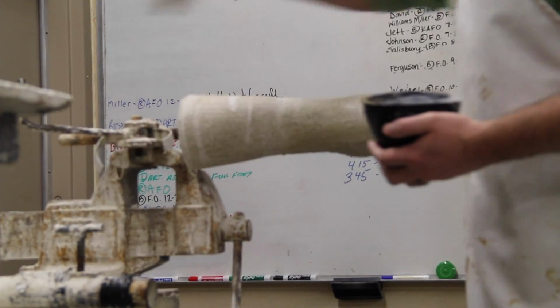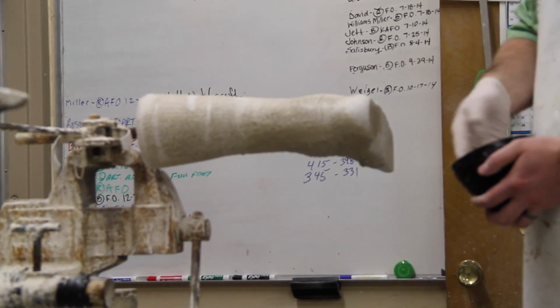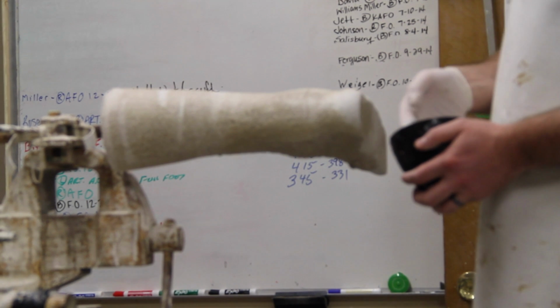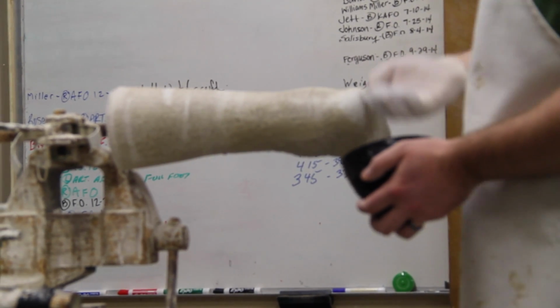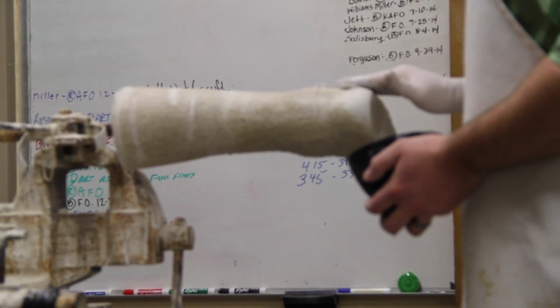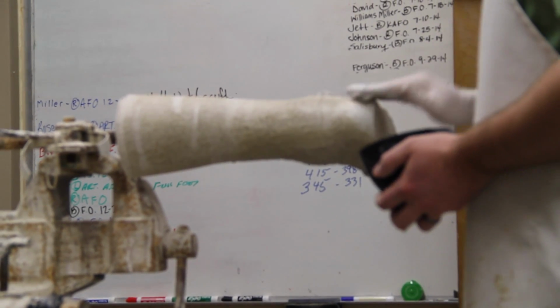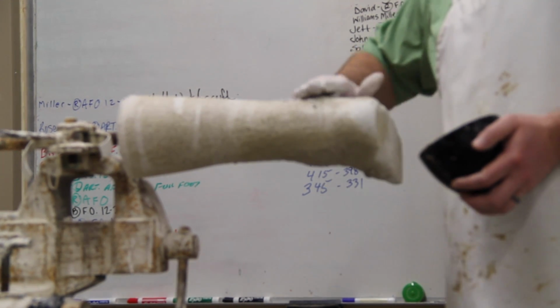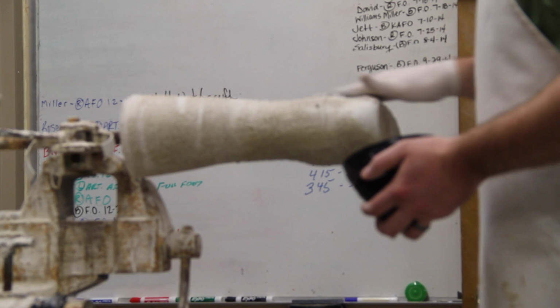The next step in the process, now that we've removed the hard cast, is to start making modifications to our plaster mold. We want to build up at both the medial and lateral malleoli and a little bit around sulcus. And then we'll flatten the foot plate to get a nice balanced AFO. We'll build up approximately 1/4 inch on both the medial and lateral malleoli.